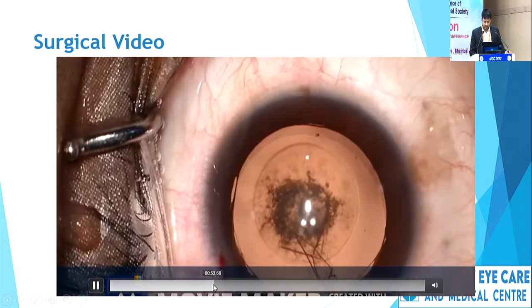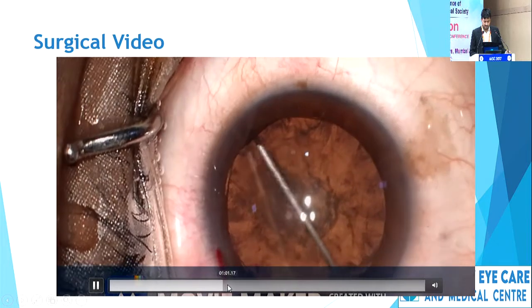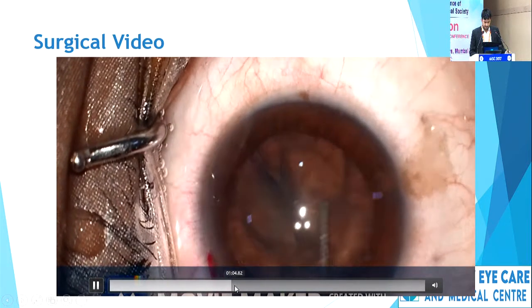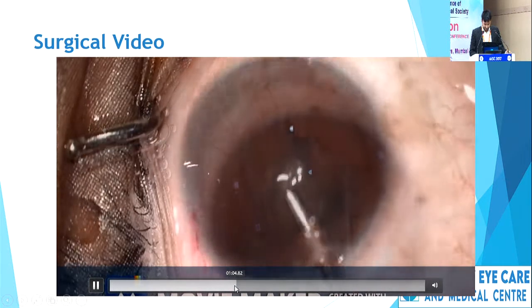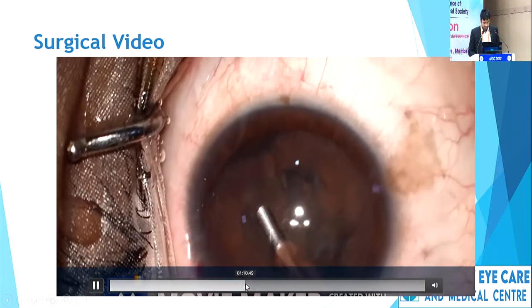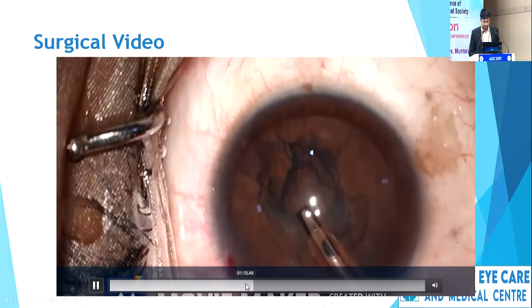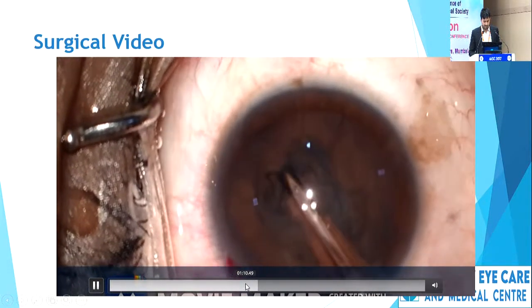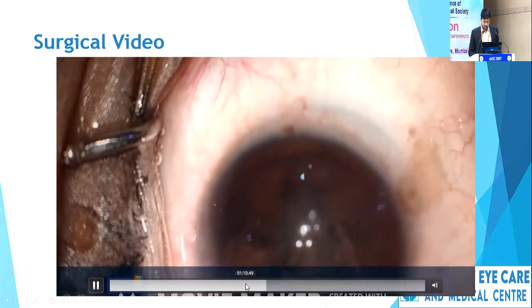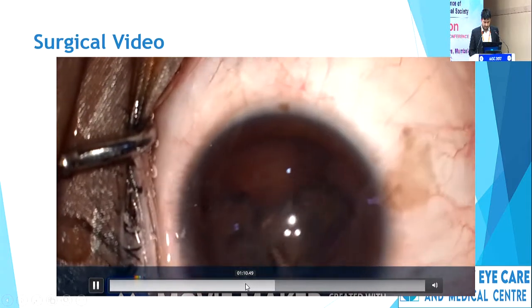My patient had a softer grade of cataract. It was NS1 with a central PSC. Gentle hydrodissection. The softer ones can be tricky at times. In this case, I could just get the nucleus emulsified without chopping it. I tried to get it out of the bag as much as possible, and I could emulsify it in the AC itself.